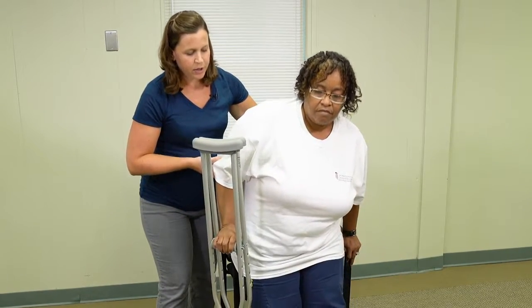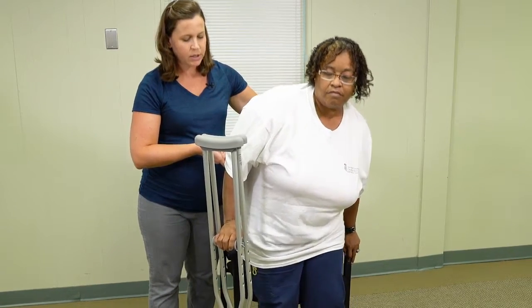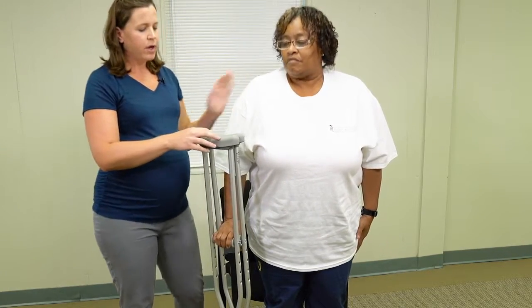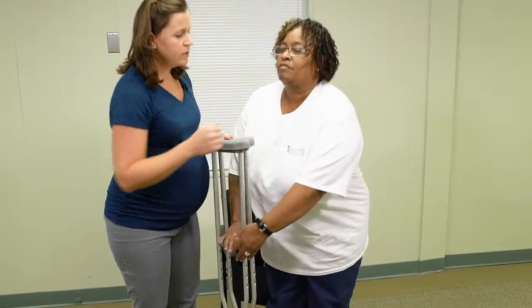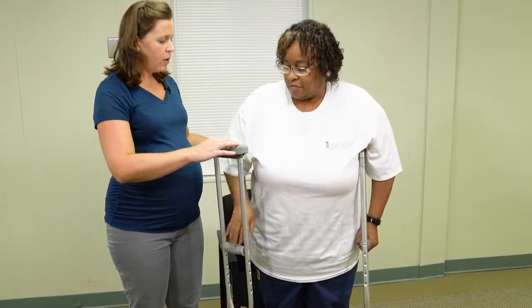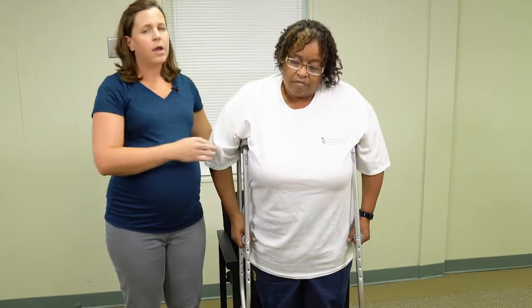As you come up, bring your affected leg up next to you. Good. Make sure you have good balance. And then bring one crutch over to the other side. There you go. And then go ahead and place this crutch in. Now you would be ready to walk.